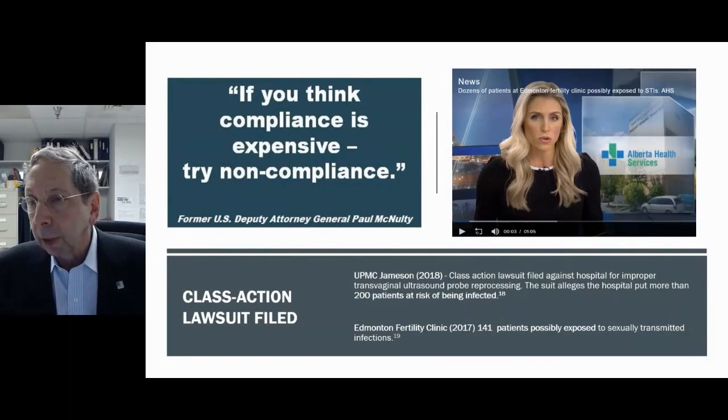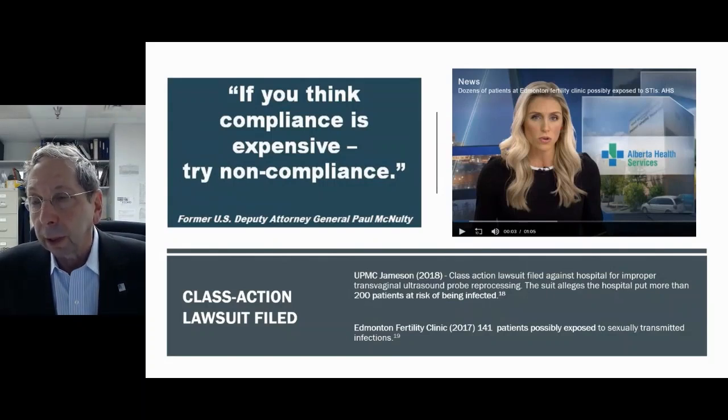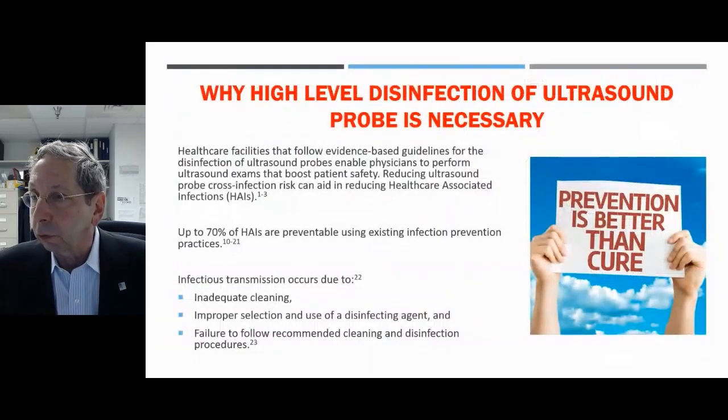So if you think compliance is expensive, try non-compliance in the United States and certainly in other places in the world. There have been lawsuits claiming that patient infection resulted from use of low-level disinfection, and therefore patients became infected. Those lawsuits have led to payments and, of course, potential stigmatization of the providers as well. And again, our goal is to use ultrasound safely and protect our patients.